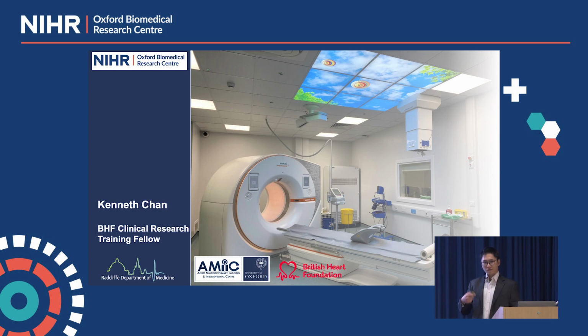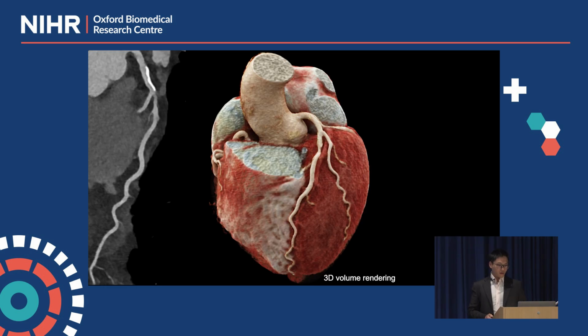Every day it serves dozens of patients presenting with chest pain or breathlessness symptoms to find out if this is related to the heart. And cardiac CT scan has become one of the first-line non-invasive tests to visualize the heart vessels to see if there are any significant narrowings of the heart arteries due to the buildup of plaques, as we can see in one of these plaques.